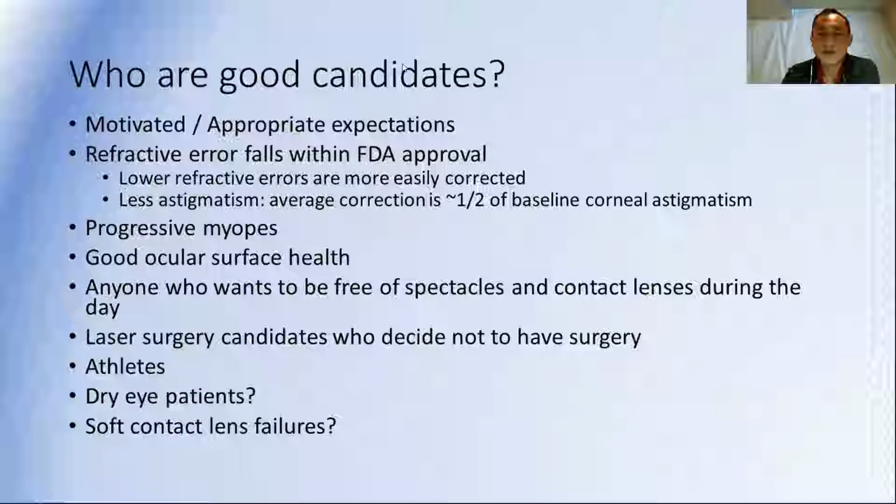Have you seen a rebound increase in myopia after stopping Ortho-K lenses? Again, I think that depends on the patient and when you stop treatment. If this patient were going to continue to progress to age 25, but you stop at age 18, yes, they're going to continue to increase. But if they would have stopped at age 18 and that's when you stop, then you probably will not see an increase. For the patients that I've had who have stopped treatment at around age 18 or age 20 or age 22, I actually have not seen an increase beyond that, but that's not necessarily because of Ortho-K treatment. I think that's just because those patients would have stopped changing at that point anyway.